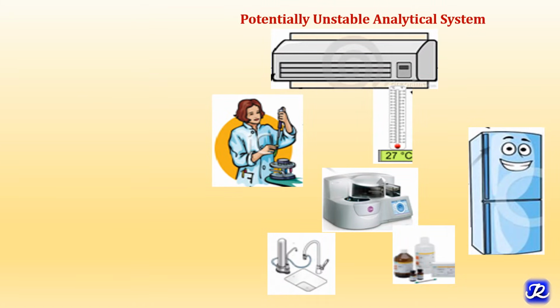During your laboratory visit, you have seen our clinical biochemistry laboratory, and in the clinical biochemistry laboratory, the analytical system comprises many factors like maintenance of temperature, the technician or personnel doing the test, the instrument itself, the washing conditions, the reagents and control materials, and their storage.